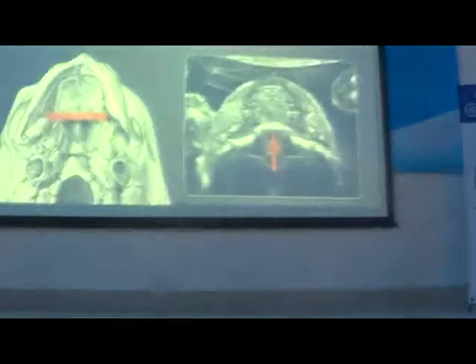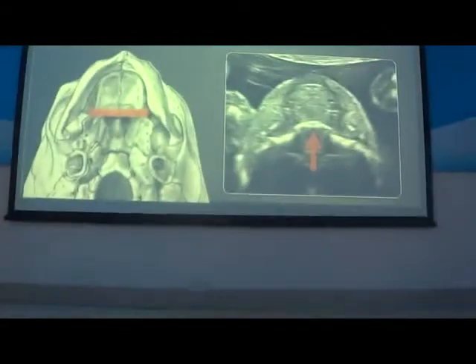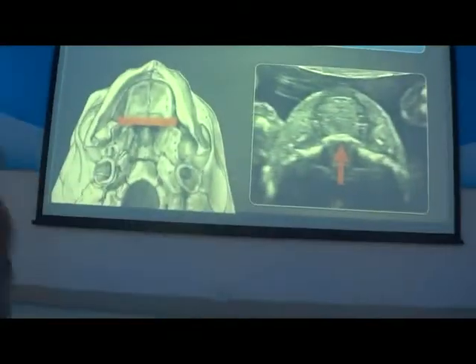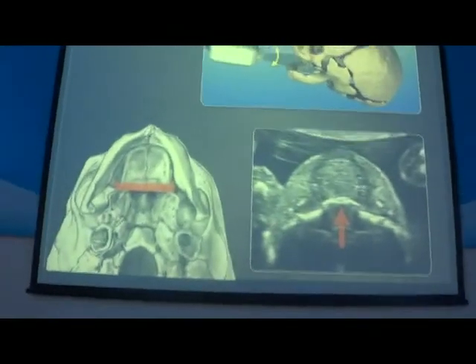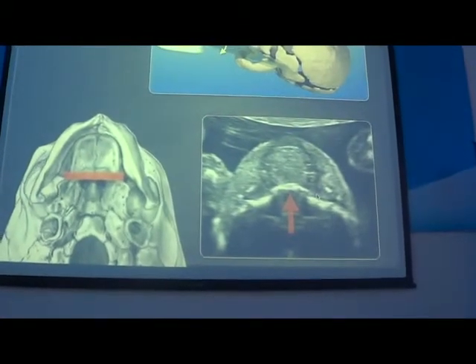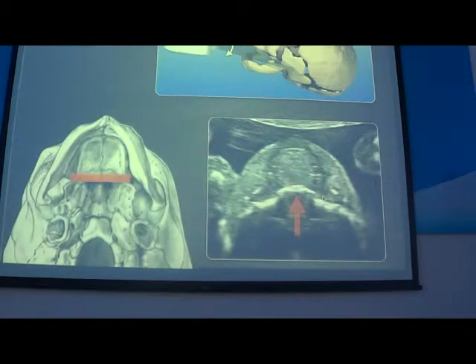You put the probe, the ultrasound beam, exactly between the maxilla and the mandible, so that it is not blocked too much. And when you are in this position, you just tilt the probe up and down, and you try to find the posterior edge of the palate.